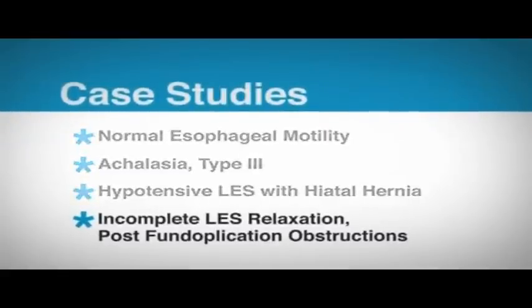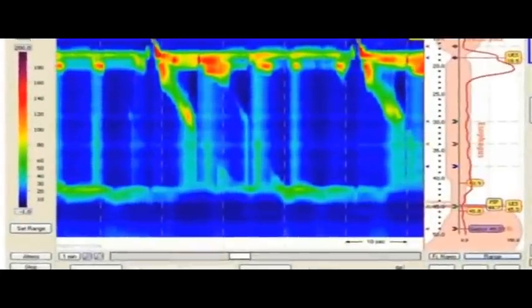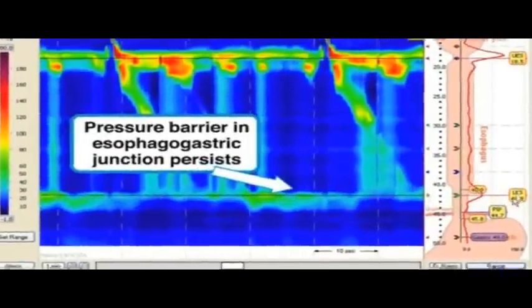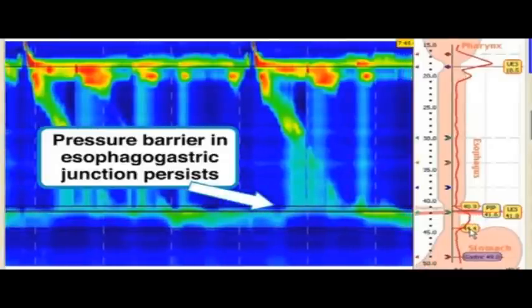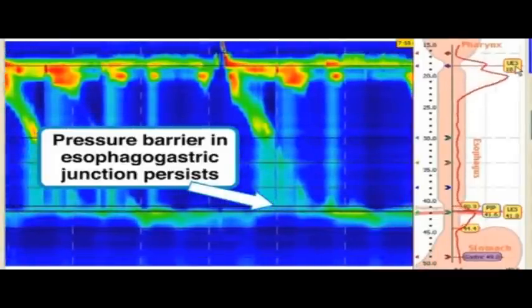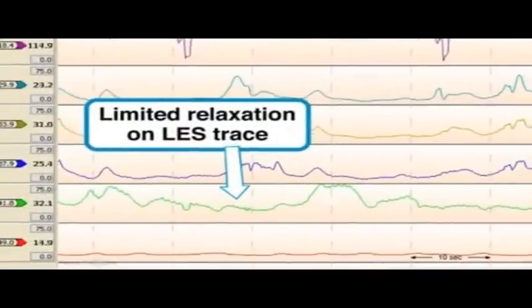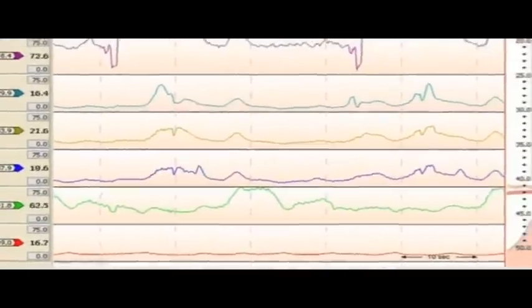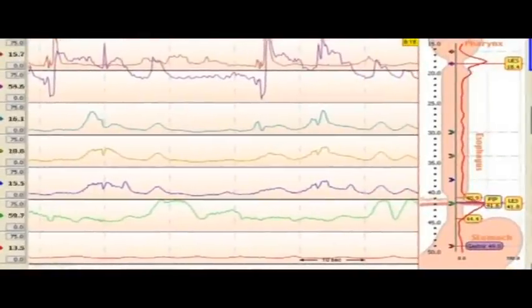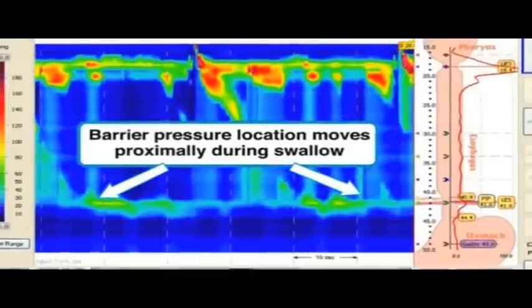Incomplete LES relaxation, resulting from post-fundaplication obstructive changes. In this post-operative case, the pressure barrier at the EG junction persists at a time in the swallow sequence when the LES would normally relax. The sphincter appears to relax in the line tracing, but the high-resolution view shows that the barrier pressure region has moved proximally during this phase, causing symptoms of dysphagia.